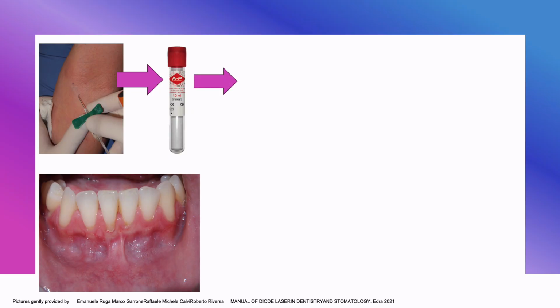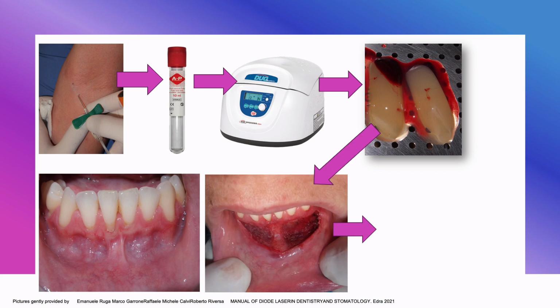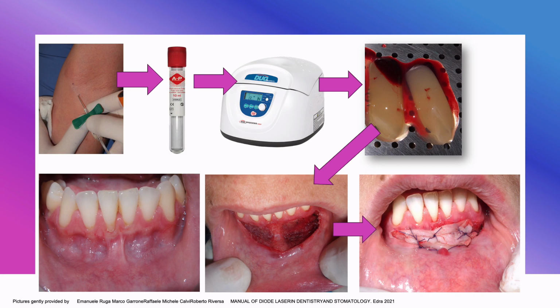In the present clinical case, a half-thickness periodontal incision is performed with a diode laser to solve pathological periodontal traction caused by multiple frenums. After blood collection and a proper centrifugation protocol, PRF membranes are used in combination with the diode laser to obtain a fornixplasty and to increase tissue quality and thickness. Polyglycolic acid resorbable sutures are used at the end of the procedure to stabilize the autologous PRF graft.